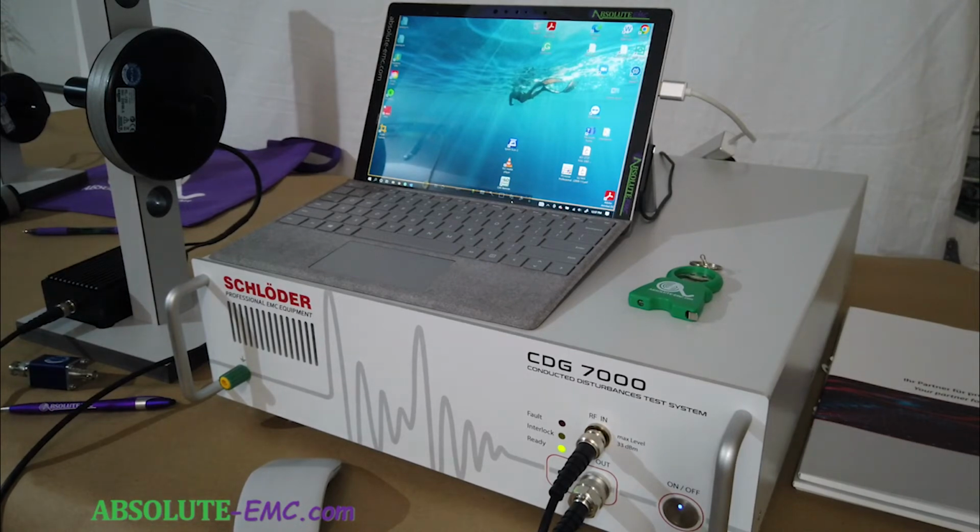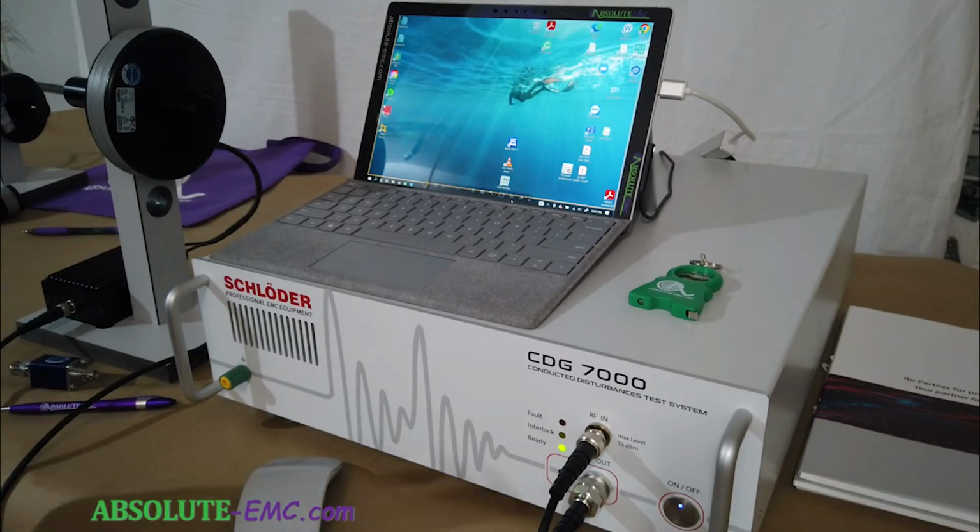Alright, so we're going to go over how to set up and use the software for doing the magnetic testing for the medical requirements. To install the software, I've already had it installed on this computer, so I'm not going to go through that again, but I'm going to explain a little bit. The install wizard is on the memory stick that's supplied with the system. When I installed it on this computer, it did take 3 times to get to fully install. This computer was sitting in storage for a number of months, so it had to also go through a number of Windows updates, so that probably contributed to that. But if the Helia test software doesn't install, just reboot and try it again, and eventually everything will come through.